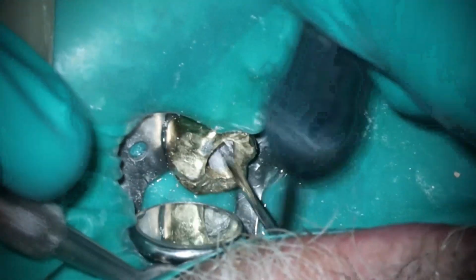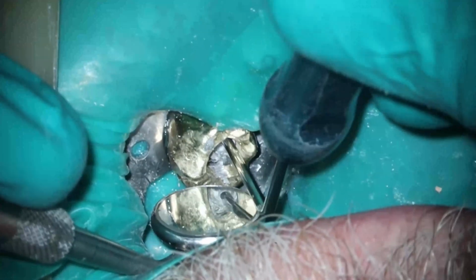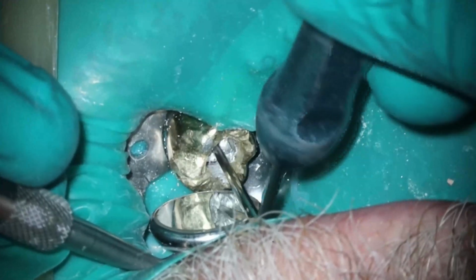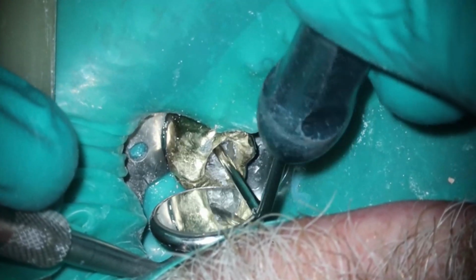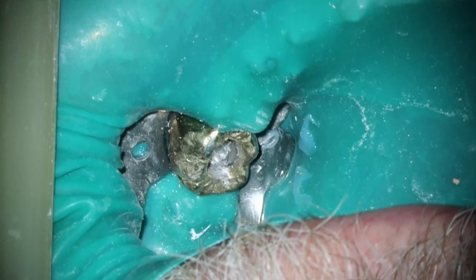I would use more and more of it if I could, but the general dentists in my area really don't like it unless it's for this case right here. So I tend to only use amalgam on friends and family, and gold crowns like this. I think it's the best material for posterior buildups, especially if you're going to be doing a new crown on top of there. Who cares about the aesthetics, because you can block it out.